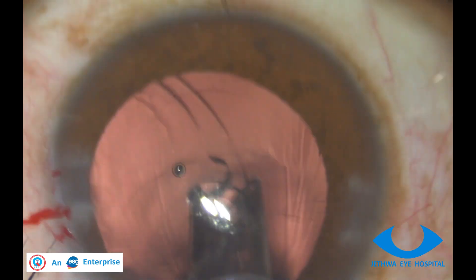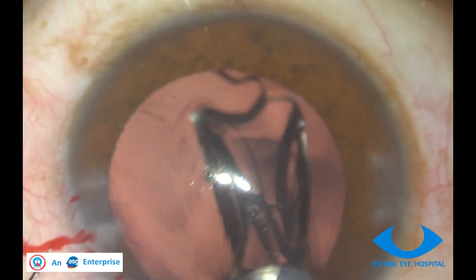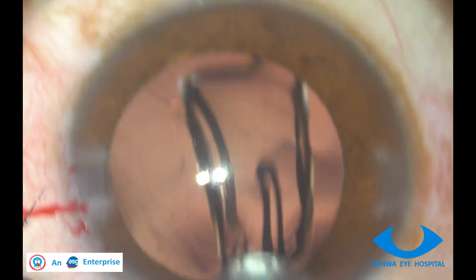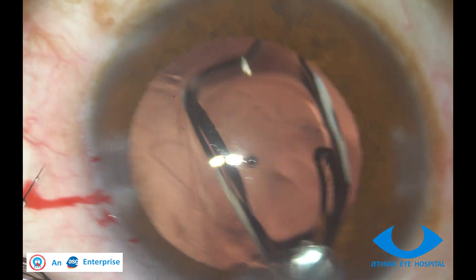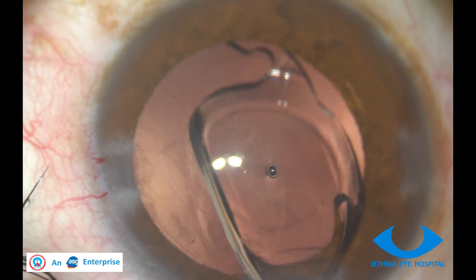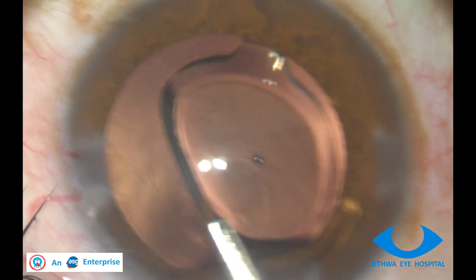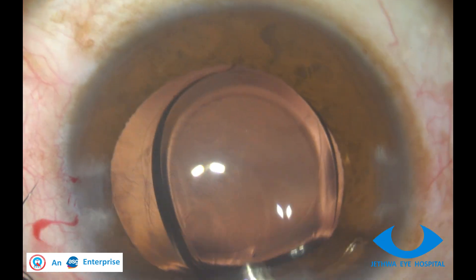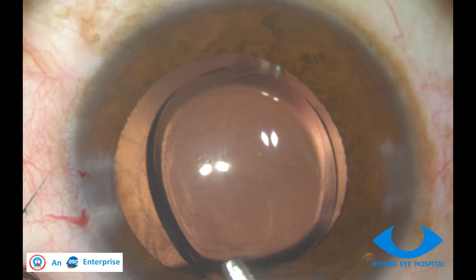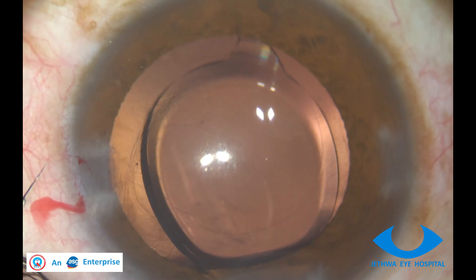Implant the leading haptic in the bag very carefully and gently. Unfold as slowly as possible. Once it is confirmed that the leading haptic is in place, inject extra methylcellulose over the optic of the IOL to make the chamber deep.